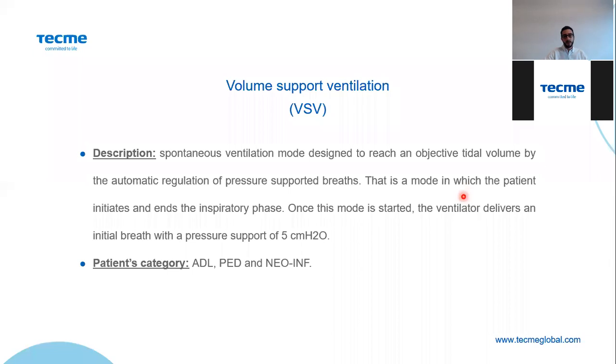So this is a mode in which the patient initiates and ends the inspiratory phase. It is available in all patient categories: adult, pediatric, and neonatal.